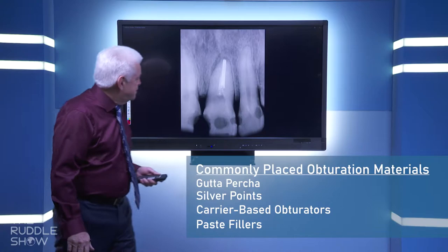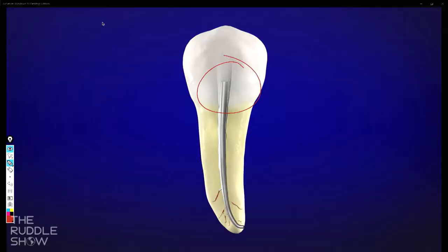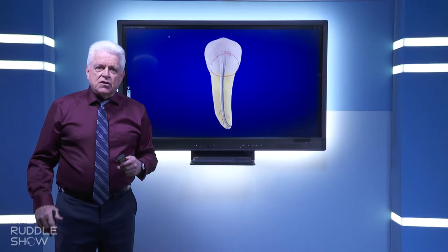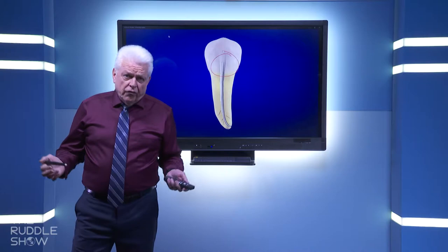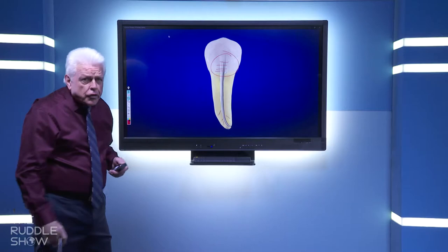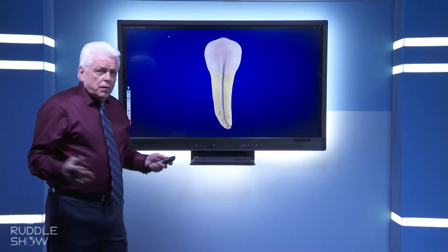Well, when we retreat, we have to think about the silver point up in the chamber, because that part can easily be hit with a burr when we're reintroducing our armamentarium to get access. As we drill down and brush away tooth structure, metals, composites or cements, it's easy for that burr to inadvertently hit the top of the silver point, and all of a sudden it can get shorter, and then it's much harder to get out because there's no handle. This is the handle that we could use to get a purchase on it to actually remove it. So be careful on your access and plan it thoughtfully.